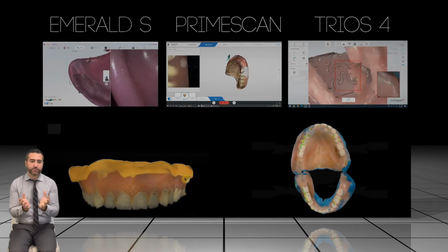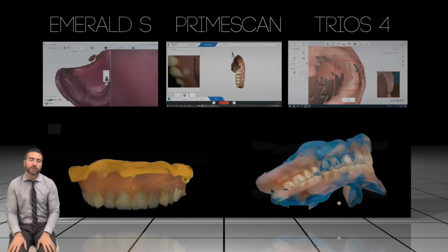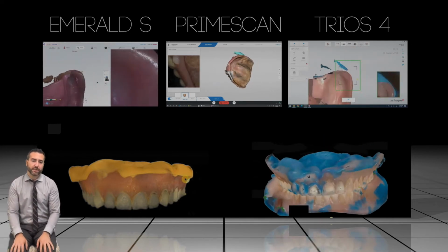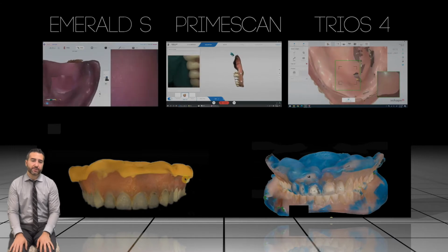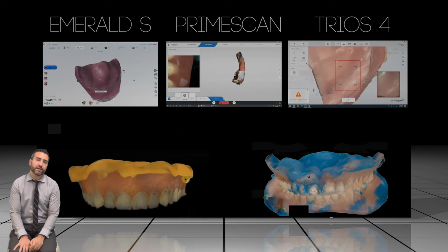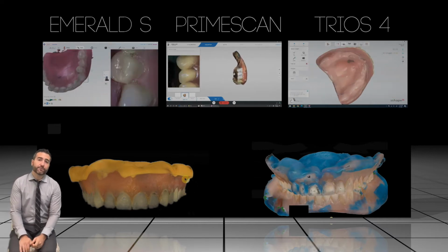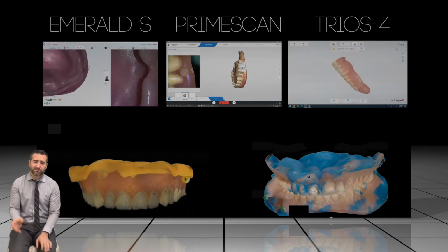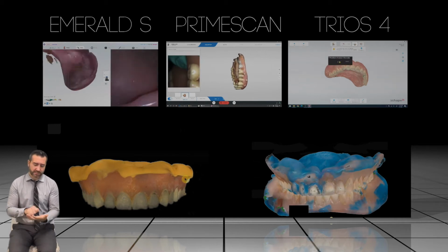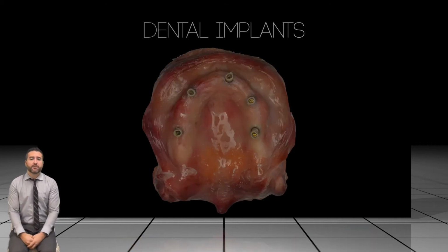So it's really cool to be able to just cut out a lot of the errors that occur with new dentures. So these copy dentures and these reline copy dentures are very, very, I would say, powerful for the patients, because you're not having to duplicate their denture and use it as a custom tray. You're able just to scan it right there in real time.